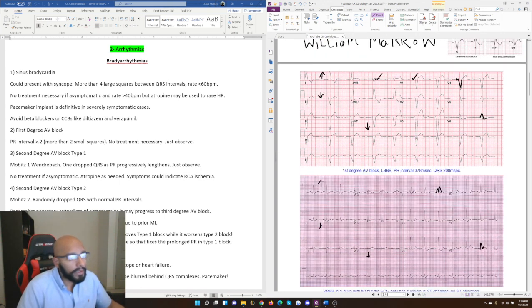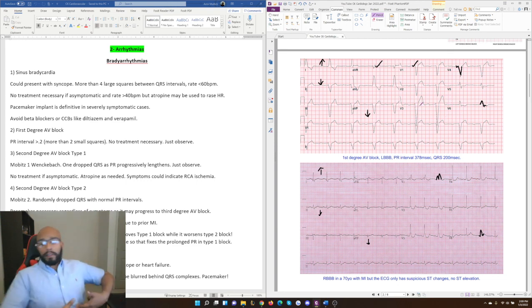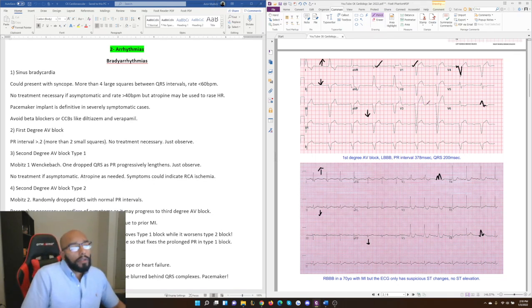So if we come back to this ECG right here, that R-wave progression is heavily messed up. V4 was supposed to be the strongest guy going up like that, and it's not. In fact, the strongest is V3. So V3, remember the way these leads are placed, V3 is more towards the left side, kind of looking at your right ventricle, sort of almost between the right and left ventricle in between. So there's a block happening. Okay, when V3 is your strongest voltage, and it's pointing down like this, that means that the electricity is going away from the direction it's supposed to go.